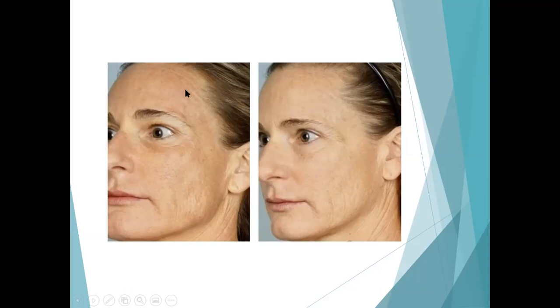She's also got some fairly deep lines up here, some fairly deep lines around her brow. This is a fairly significant amount of sun damage. And the ideal treatment plan for a patient like this would be to do both Vivace and CoolPeel. And she could still benefit from some additional treatments, by the way, but this is after a typical series of 3. And I didn't mention that earlier, by the way, but the starting series is 3.